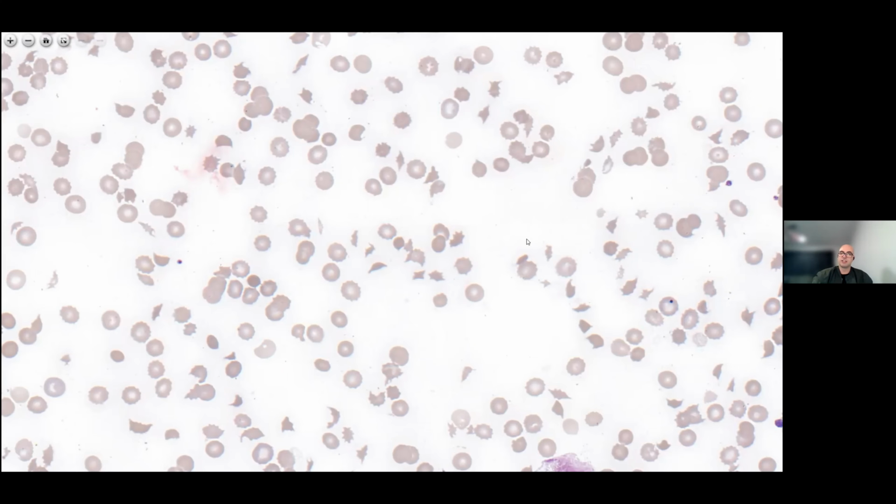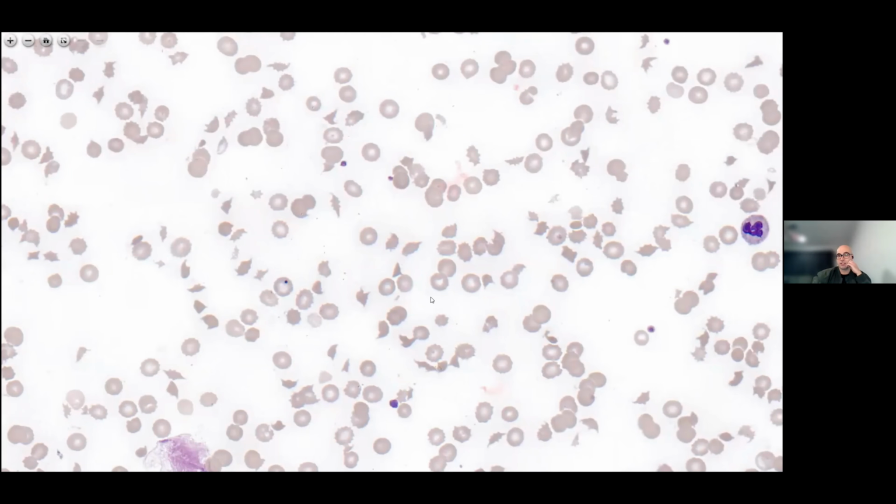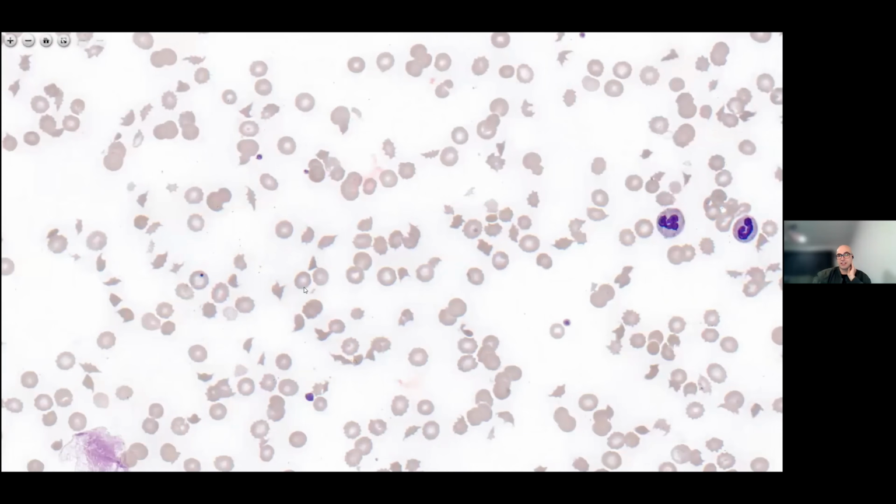They come into the blood supply. But in a healthy individual, the Howell-Jolly bodies get extruded by macrophages in the spleen quite quickly. But if the spleen's getting overworked and tired due to all this hemolysis and damaged red cells, I would expect some to start slipping through the cracks, and you might be able to see a couple on the blood film. Or this patient might have a complicated medical history and might have been splenectomized previously, and it's just a coincidental finding on this blood film, maybe. I don't know. Do you have anything to add, Alan?